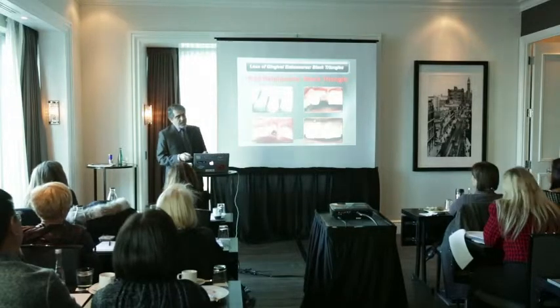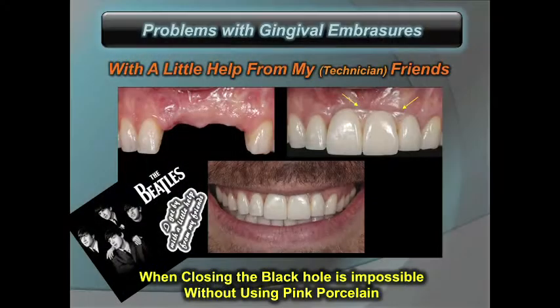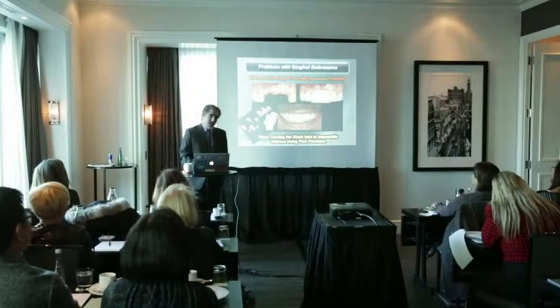And in these sort of cases, and also in more difficult cases where you have lost some space, you will be relying on the pink structure created by your lab technicians or technician friends. Without them, it will be almost impossible in many cases to restore those defect areas, and of course, you have to rely on the smile line of the patients too.